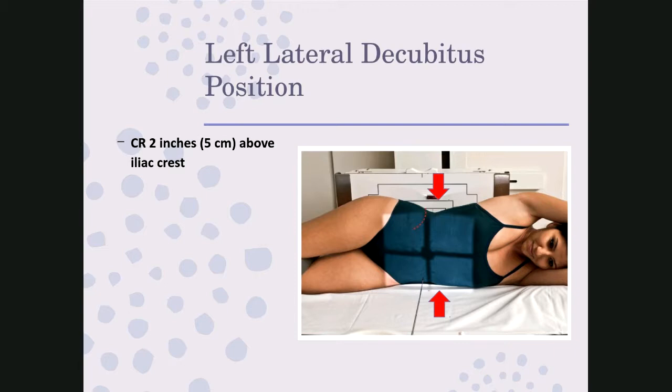All right, so minimum of 5 minutes, she should be lying on her left side in order for all the air to rise and the fluid to fall. This is done at a 40-inch SID, and you're typically on a 14 by 17 IR placed lengthwise to the patient. Her habitus is such that if you were to place it lengthwise, that would be acceptable.